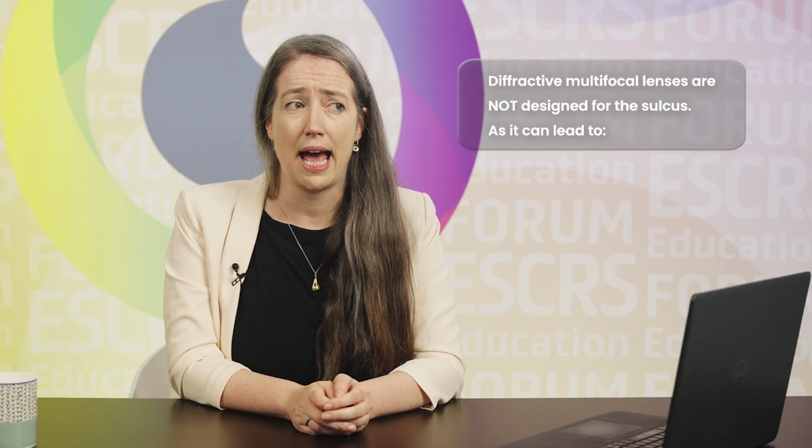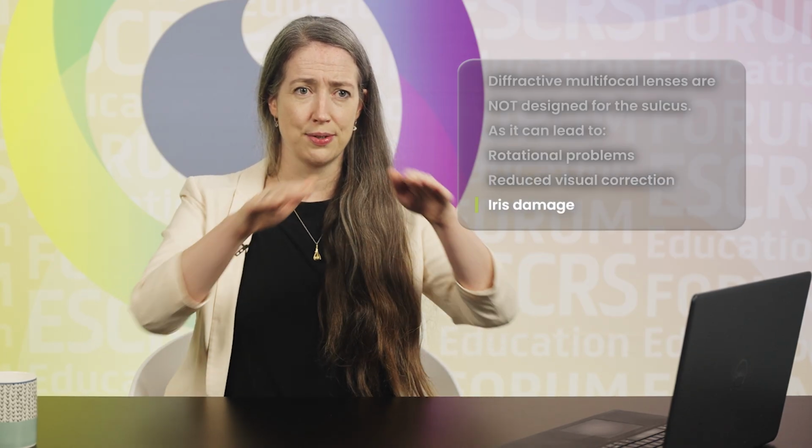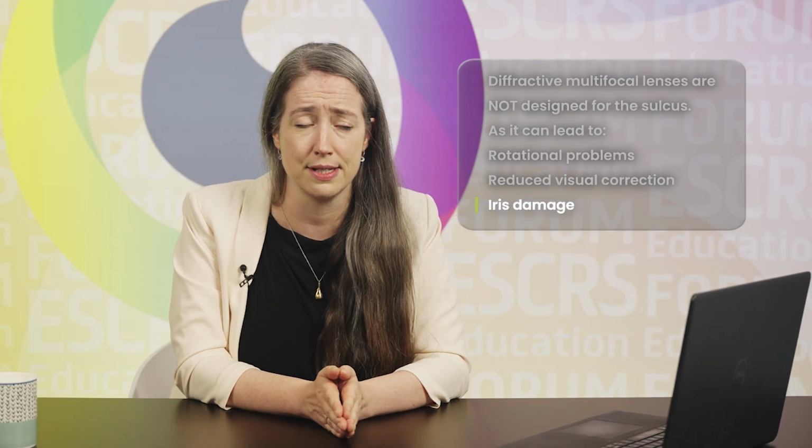So I think there's two key take-home messages here. Number one, diffractive multifocal lenses are not designed for the sulcus. And not only can they give rotational problems and reduced correction, they can also give this iris cheese grater effect and create these pigment problems. So that's number one. If you're not sure your bag is intact, don't put your multifocal lens in.